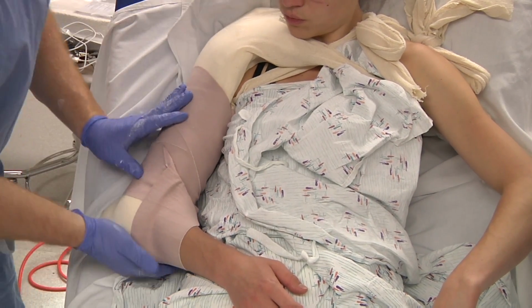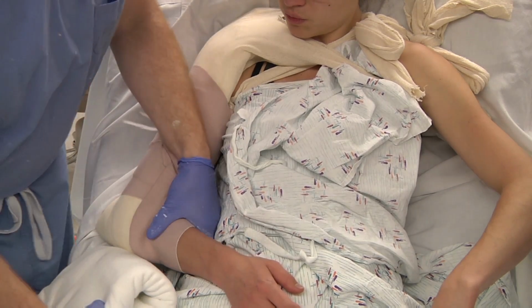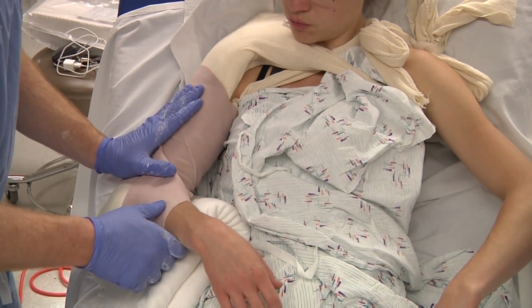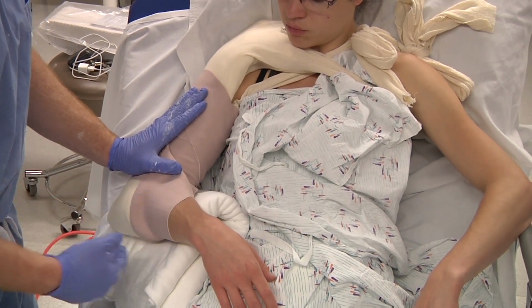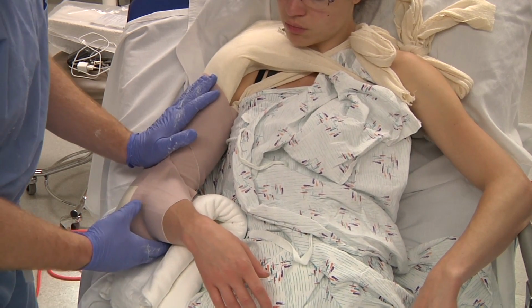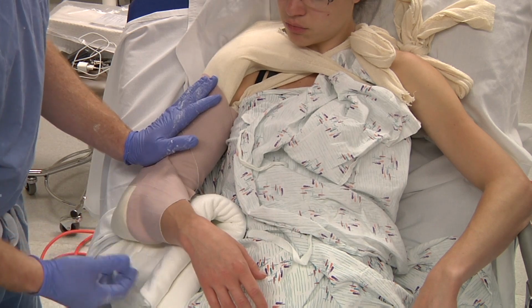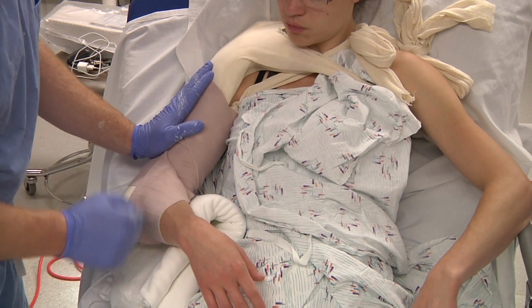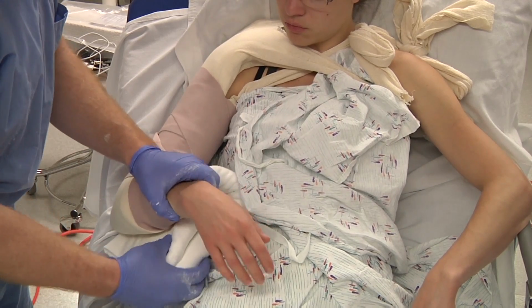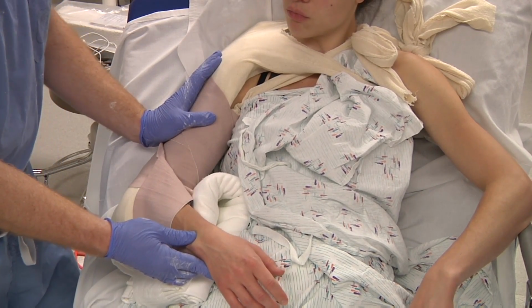Then to further avoid falling into varus, either a brace with an abduction pillow can be applied, or a pillow keeping that elbow from falling in towards the body, or into varus, as we would say. And that can be applied. Then after this, generally a sling is applied to the patient.